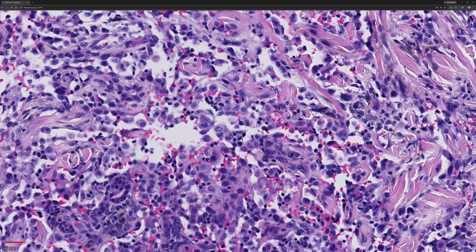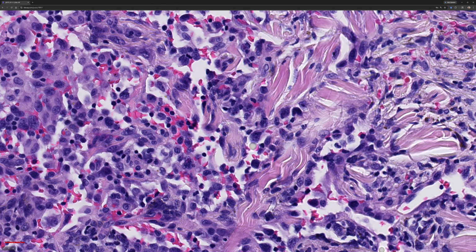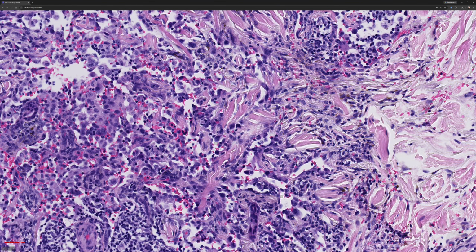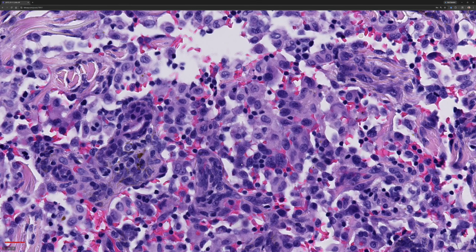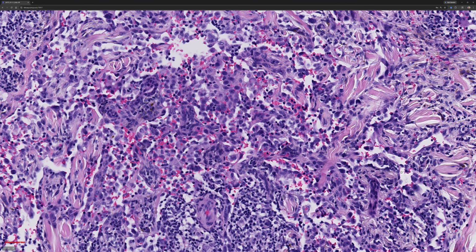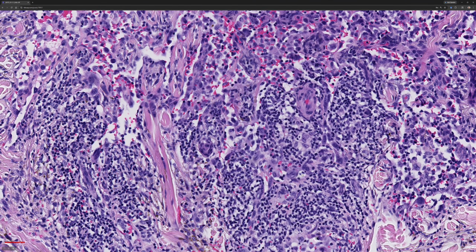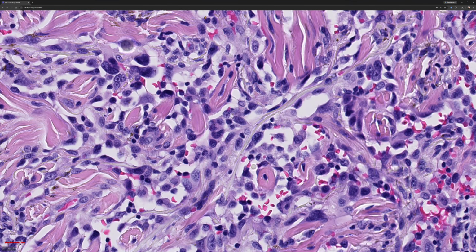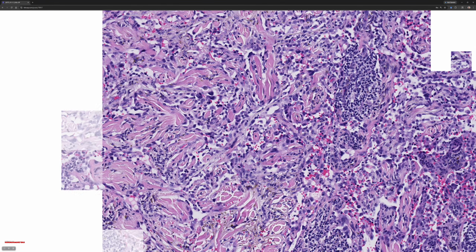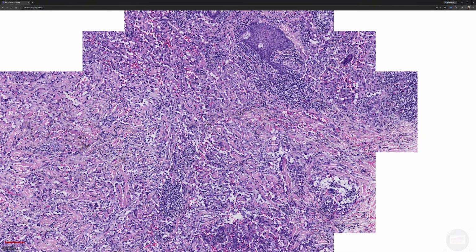And then like you said, usually you're going to have really severe, nasty, pleomorphic, hyperchromatic, ugly nuclei, often multi-layering, or the vessel lumens will start filling up with multiple endothelial cells. We're starting to see that here. My colleague, Jackie Junkins-Hopkins, was the one who introduced me to this term, fish in the creek. Sometimes the vascular channels are like the creek, and all the endothelial cells swimming along in the creek are filling it up like fish. But not good fish, like piranhas, okay, bad.